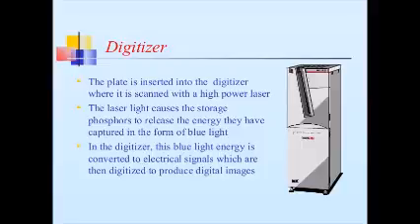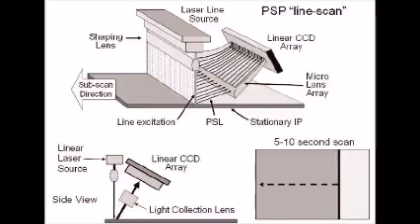The laser needs a constant power source to prevent output fluctuations. The laser beam passes through the beam-shaping optics to an optical mirror, which directs the laser beam to the surface of the IP. There are 2 types of CR readers, a point and a line scan reader.